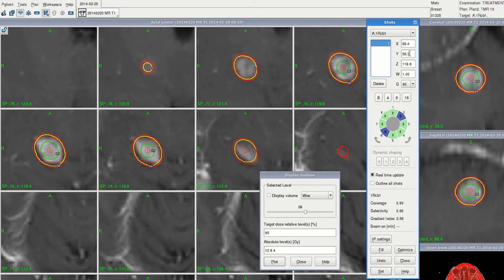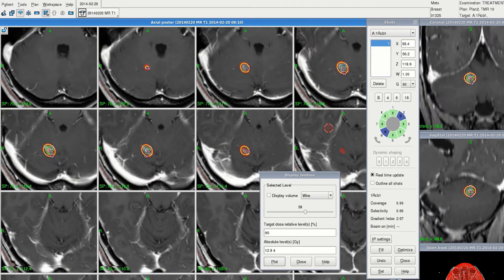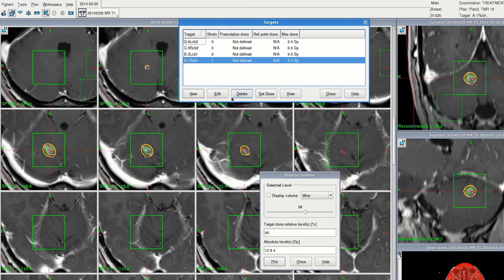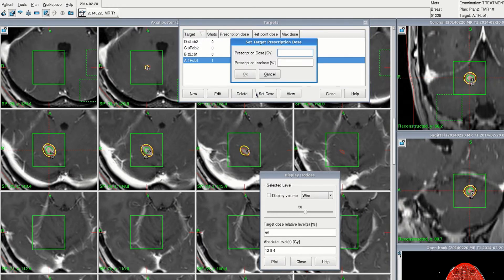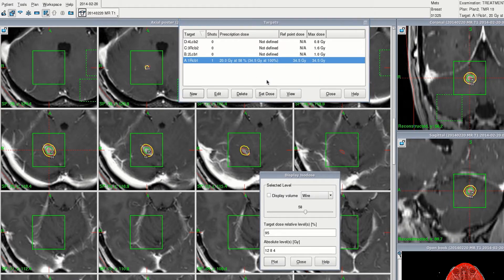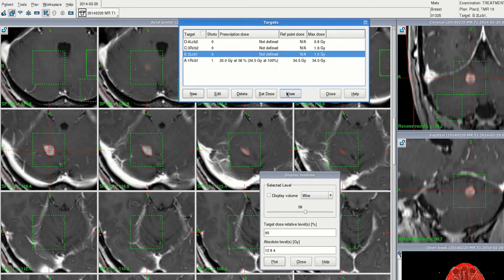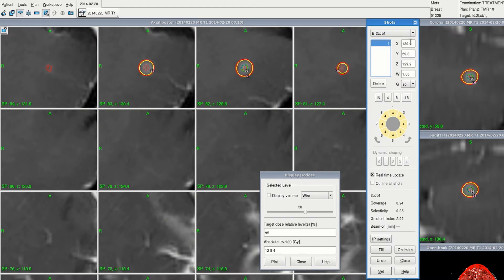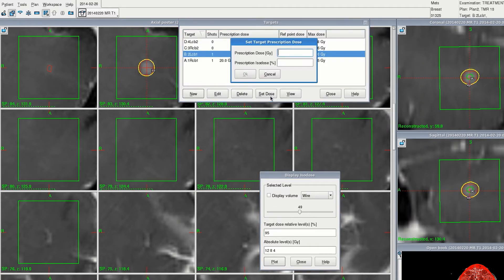So here's a reasonable dose distribution for the first lesion to the 58 percent isodose. So let's plan 20 gray to the 58 percent isodose. For the second lesion, 49 percent is a good fit, so let's plan 20 gray to the 49 percent isodose.